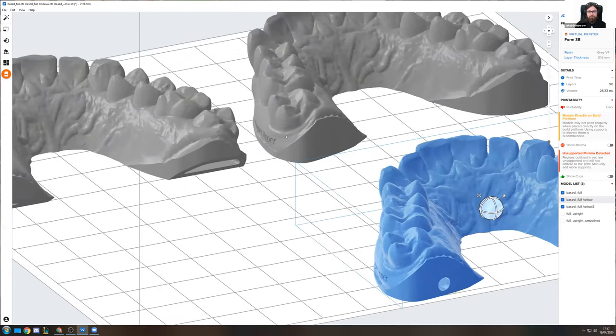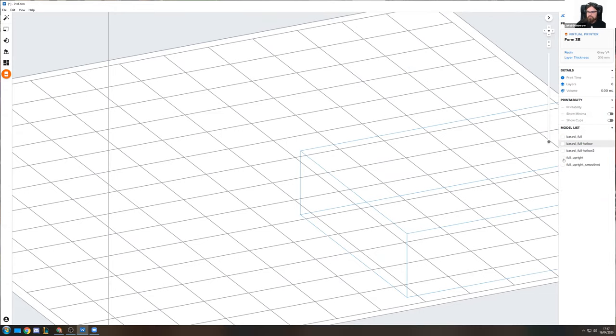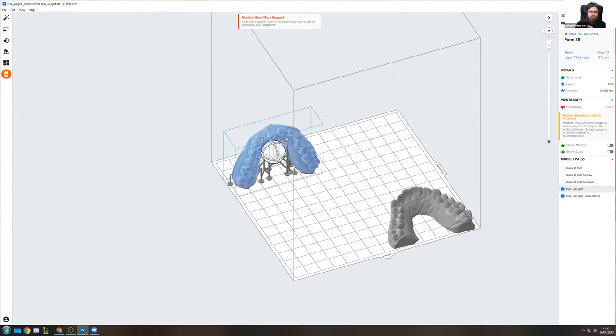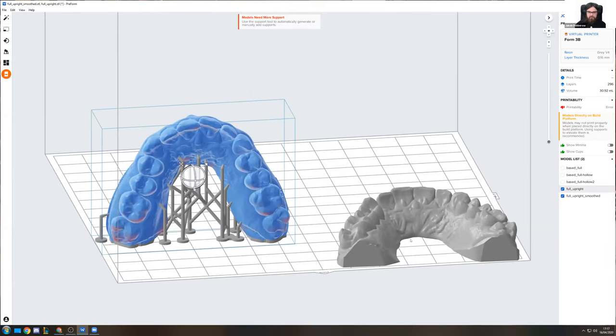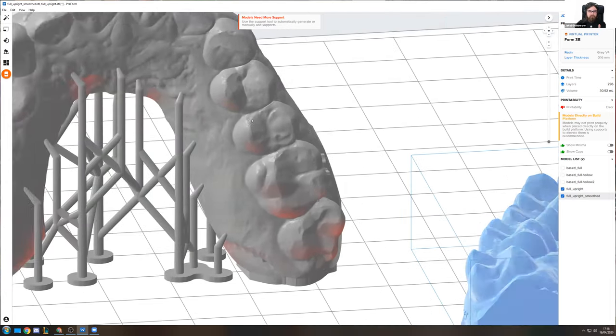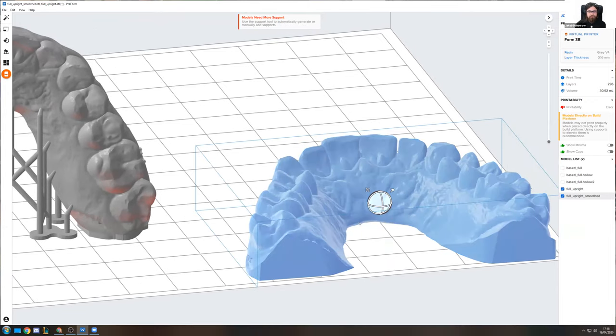Very, very easy. And then the last thing I want to show you right here, we were looking at this model that was upright at the very beginning. So this one right here, you remember from a minute ago. This model is already pretty good, but if you look very closely at this right one, you can see that I used the sculpting tool to smooth out this inner part right there. And this is a thing of experience, where I looked at this model in the model builder and saw, hey, I can see this little bump right here, and this will very likely form a minima if I turn this upright. So while I was still in the model builder, I used the sculpting tool to smooth it out a tiny bit.